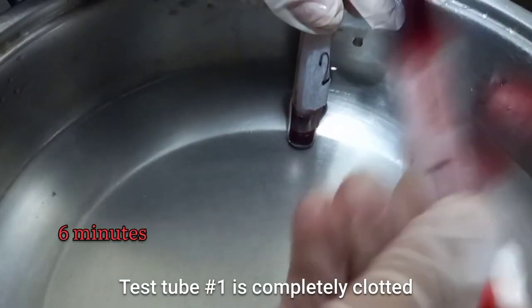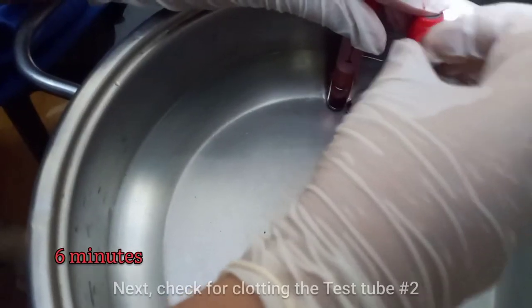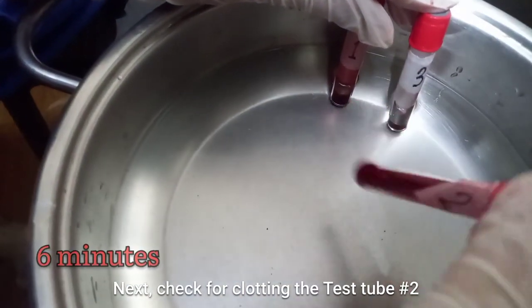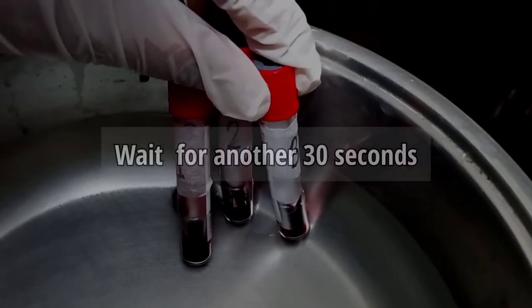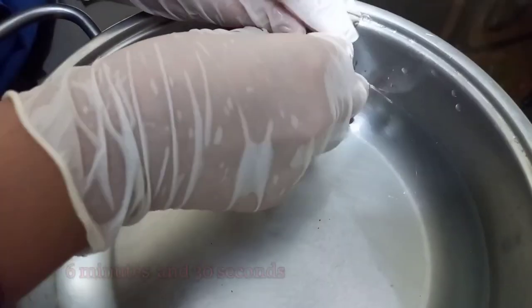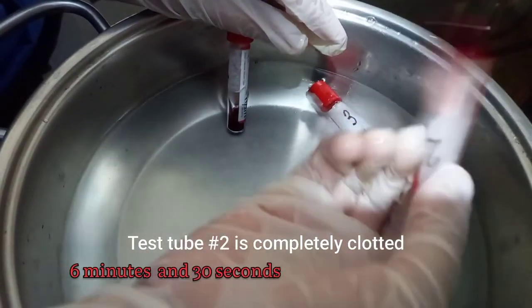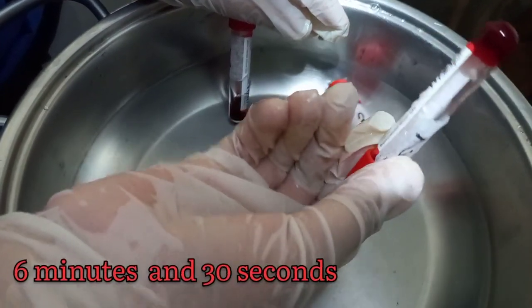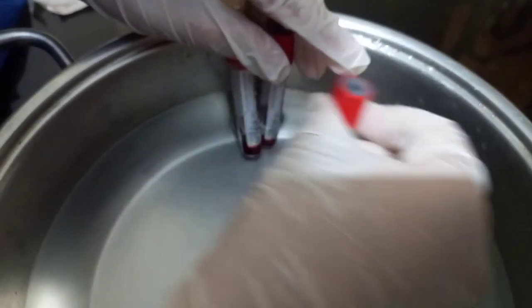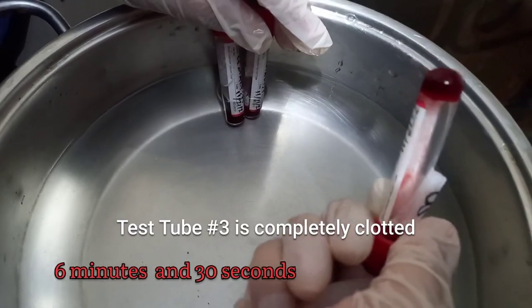Test tube number 1 is completely clotted at 6 minutes. Test tube number 2 is not yet fully clotted, so we will wait another 30 seconds. Test tube number 2 is completely clotted at 6 minutes and 30 seconds. Test tube number 3 is also completely clotted at 6 minutes and 30 seconds.